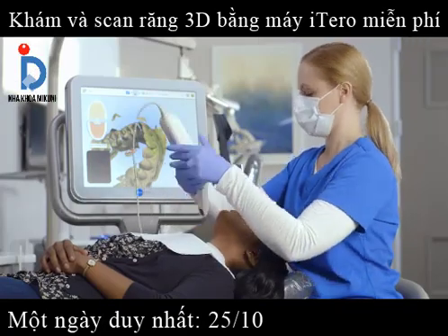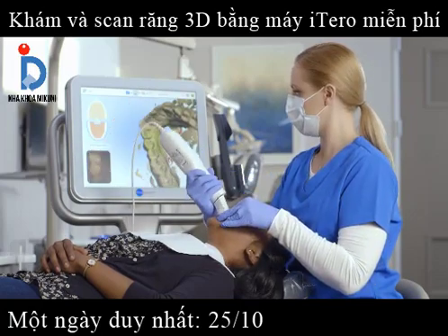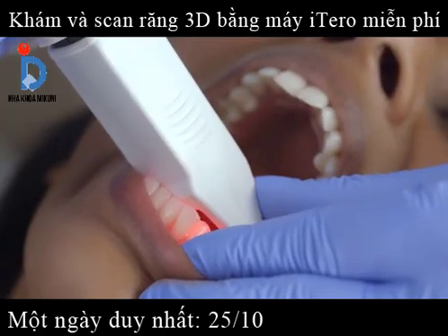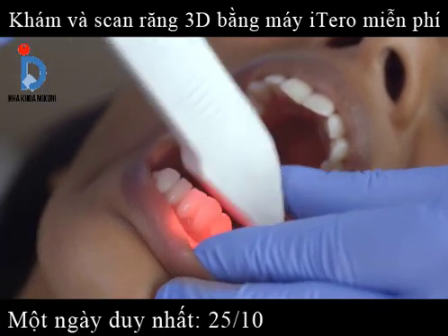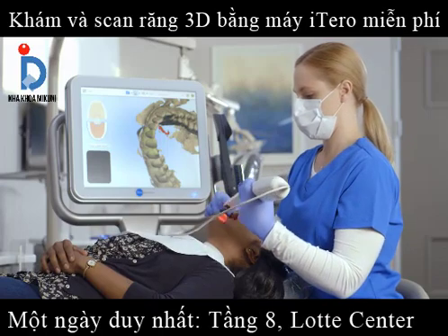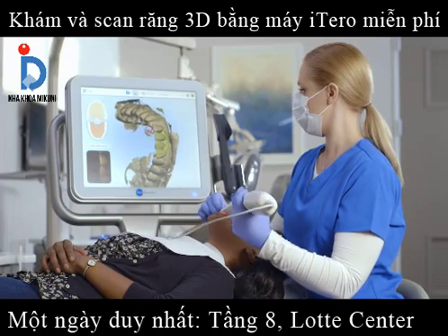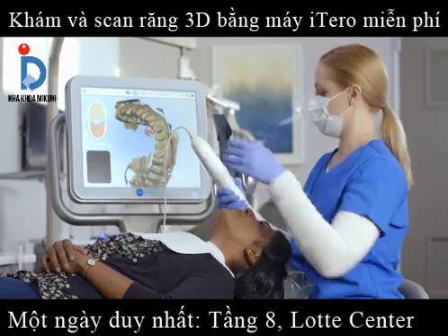Now that I've completed scanning the buccal, I'll move on to capturing the incisal anatomy of the anterior. I'll place the wand so that the cuspid and lateral are centered in the viewfinder, then roll from the lingual surface over the incisal edge to the buccal surface. I'll repeat this on the contralateral side. These scans help ensure that the lingual and buccal segments are joined with the accurate incisal surfaces. This step is critical for properly fitting Invisalign aligners.